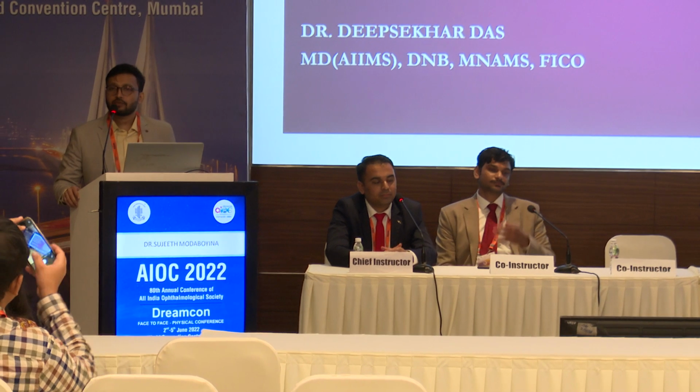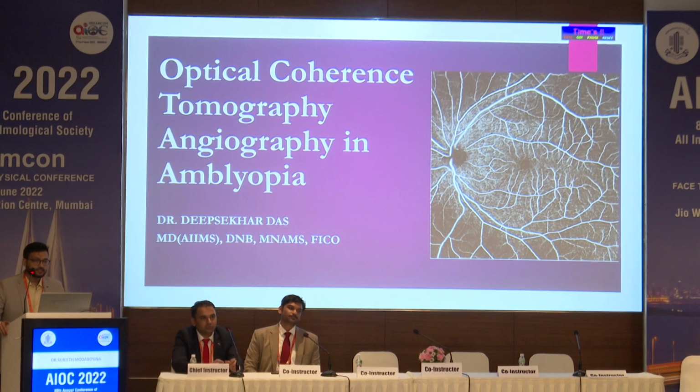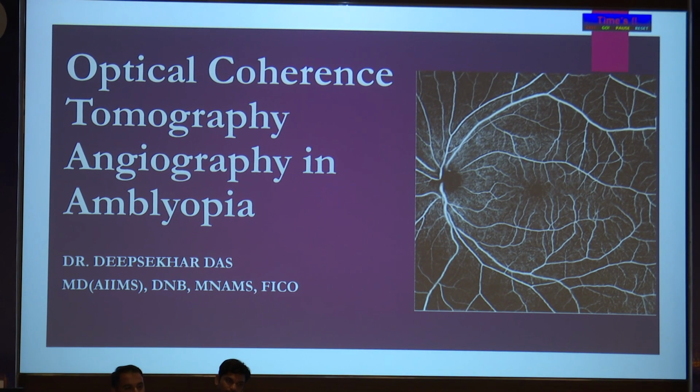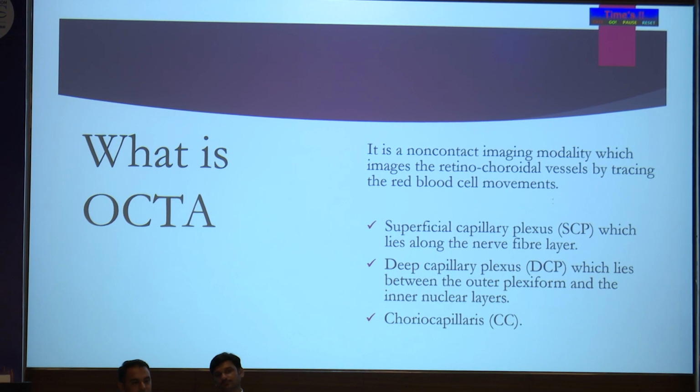A very good afternoon everyone. Today my topic of discussion is optical coherence tomography angiography in amblyopia, so it's basically OCTA in amblyopia. So what is OCTA? It's a non-contact imaging modality which uses tracing of red blood cell movements, and then it helps to form an image.